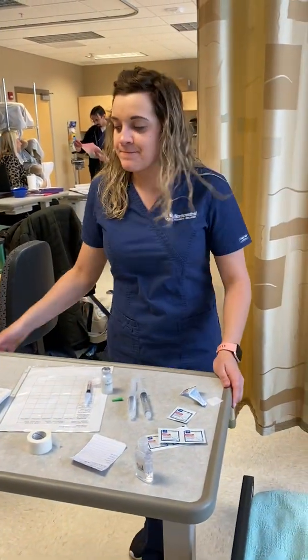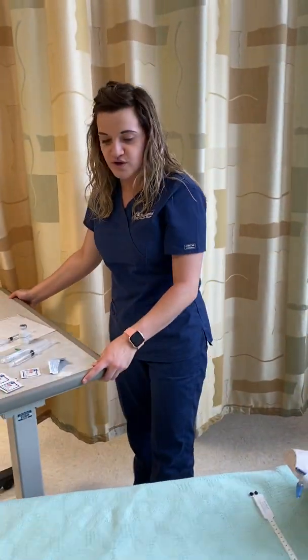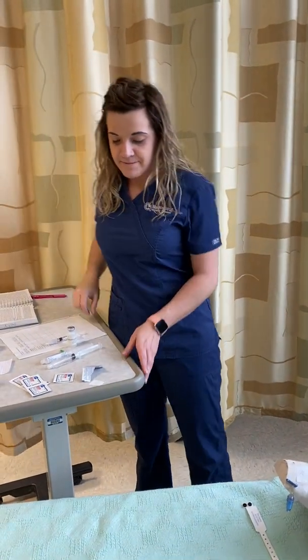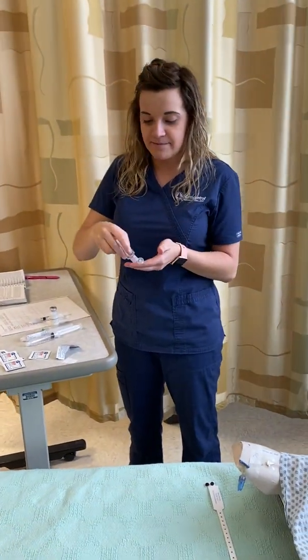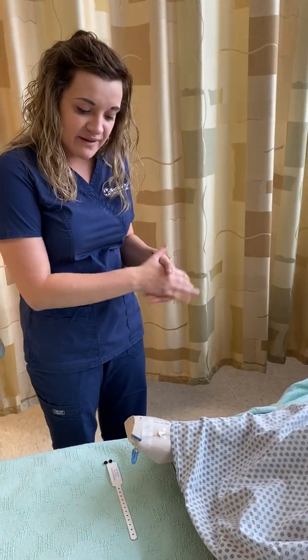Knock knock. Hi Bob, I'm McKenna. I'm a student nurse here today to give you your medication. I'm going to provide privacy. I'm going to wash my hands. Is that okay? Bob, can you go ahead and verify your full name and your date of birth for me?